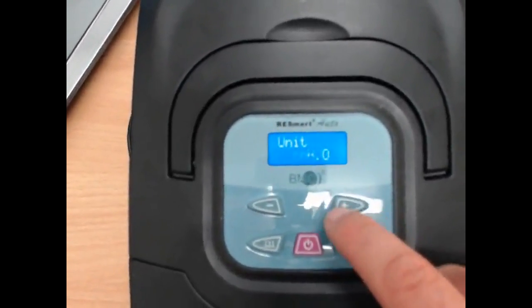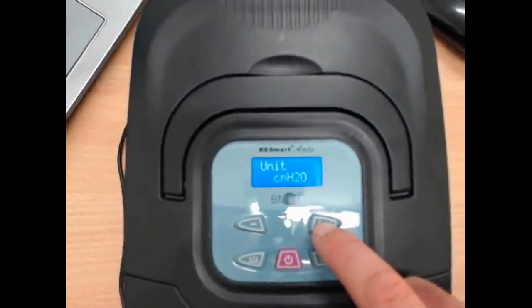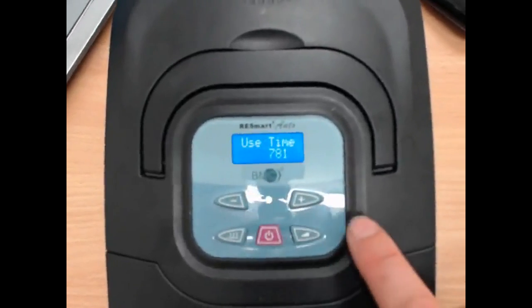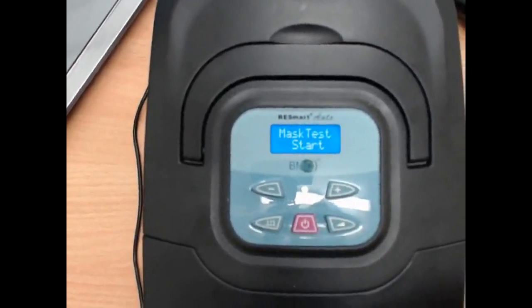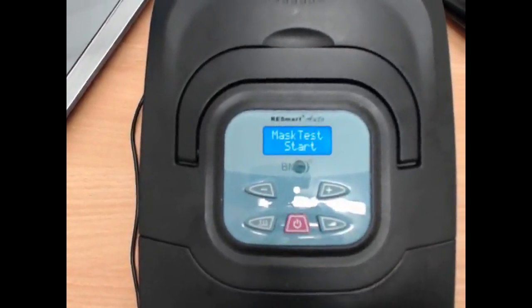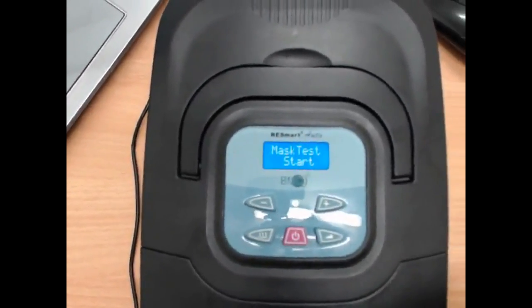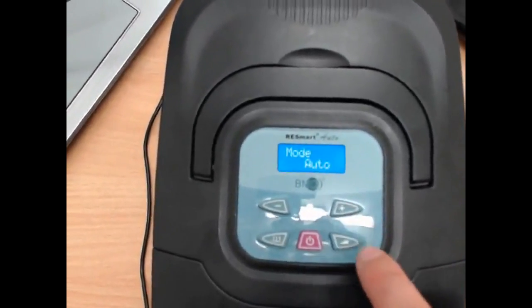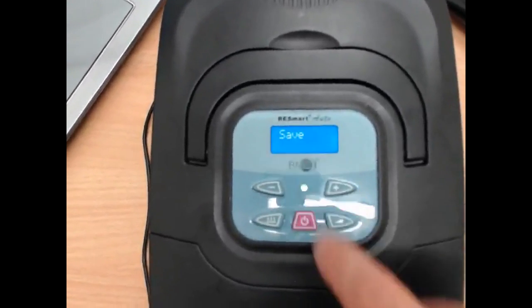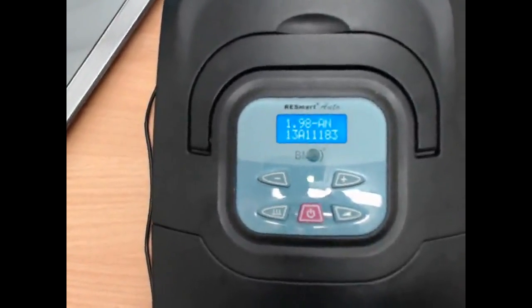Right, going on from there, we've got the units, which is in centimeters H2O, that's what we want. Use time, and we also have a mask test start. So you can put your mask on, you can click start, hit that button, and it will go through and just test your mask seal and make sure you've got your mask tight enough over a variety of tests. And then it gets to save, and we click the button and we save it.